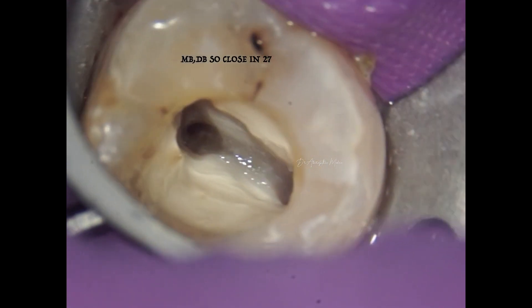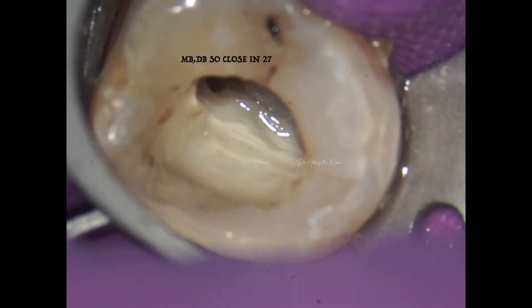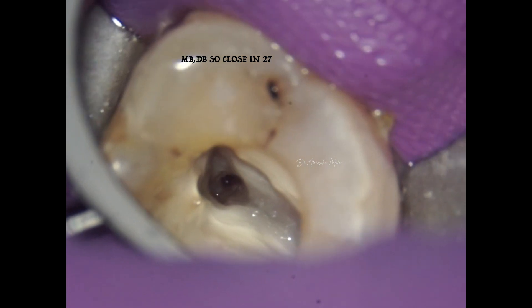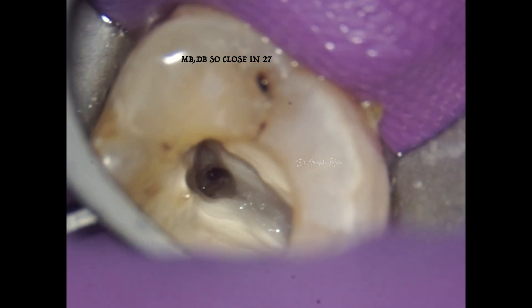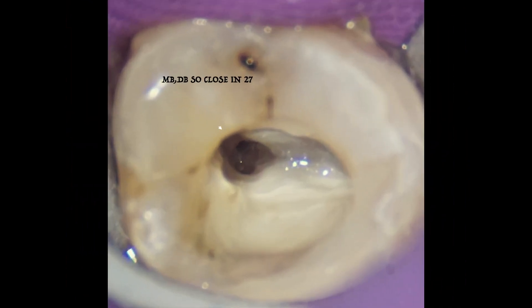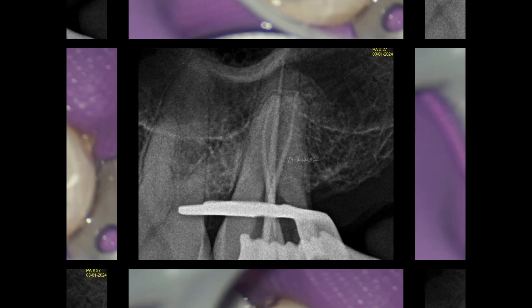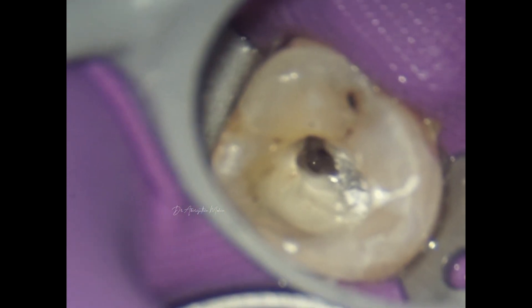What was unique about this case was that the mesio-buccal and the disto-buccal canals are so close to each other, as you can see — located almost from the same orifice, and they're also located pretty deep in the pulp chamber. Magnification plays a very important role in locating and managing these canals.